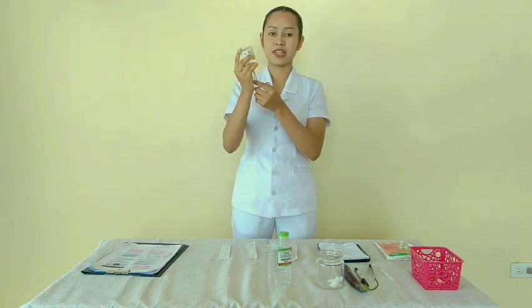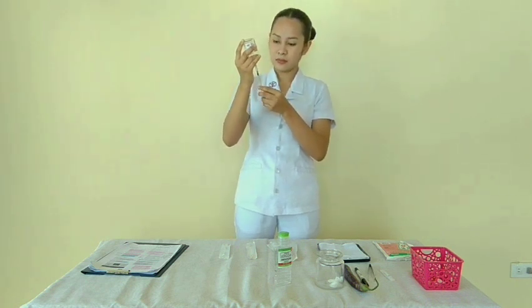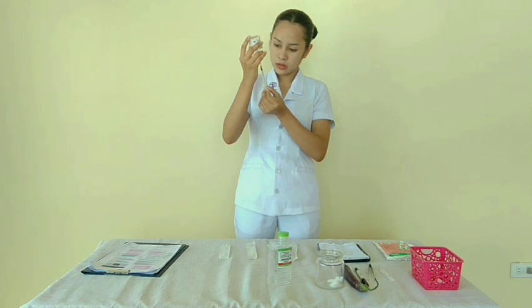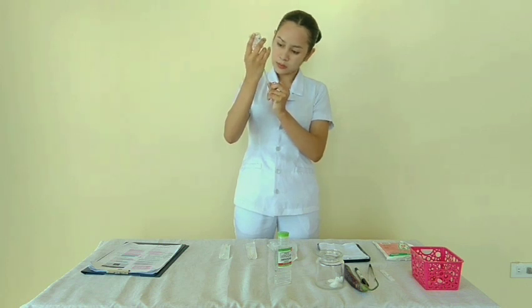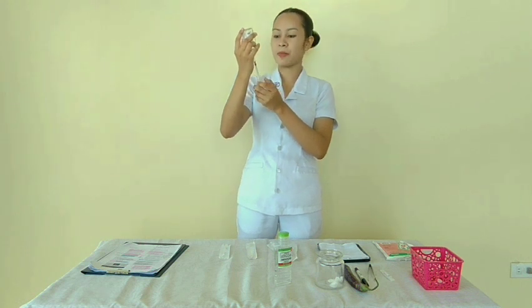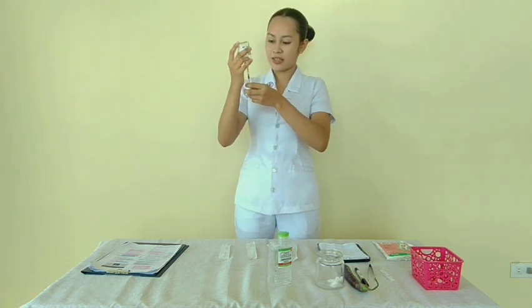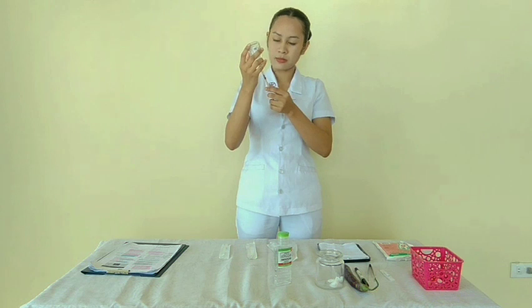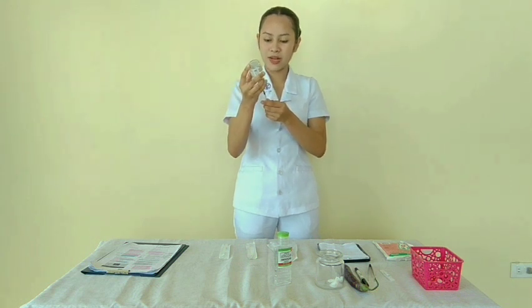And maintaining the sterility of the needle, then push the air and withdraw. And if you observe any bubbles, flick the syringe and continue. Now hold the vial down.